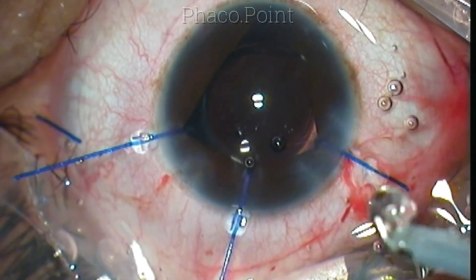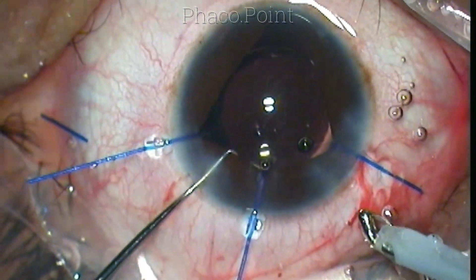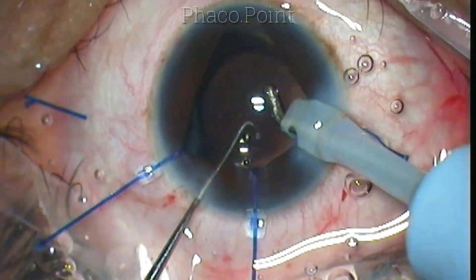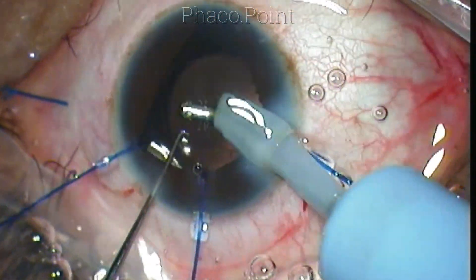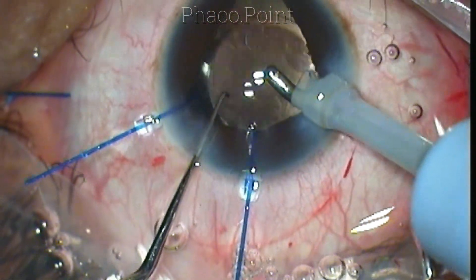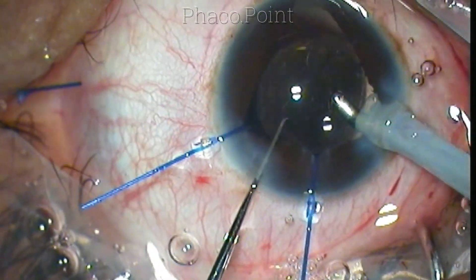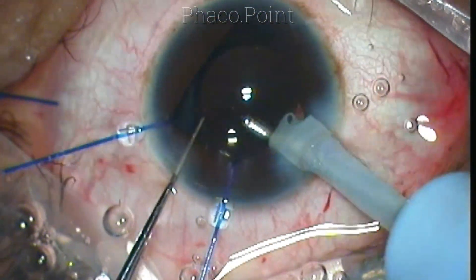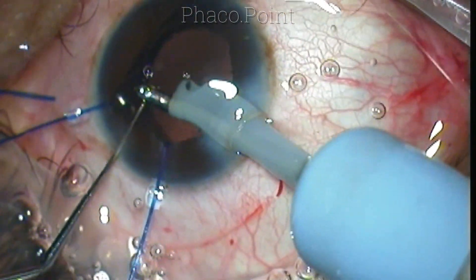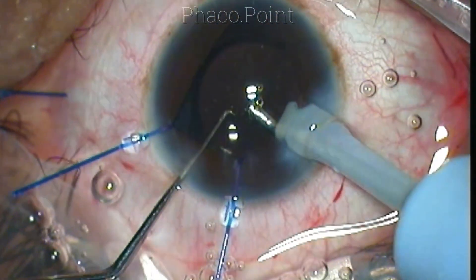Once the haptic is settled nicely within the capsular bag, the plan is to wash off the viscoelastic from within the bag. The abnormal orange glow clearly indicates the presence of a retinochoroidal coloboma. This retinochoroidal coloboma, along with the iris coloboma, was on the inferonasal side — the typical location — and it was extending up to the optic disc.